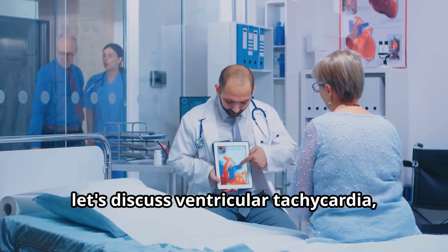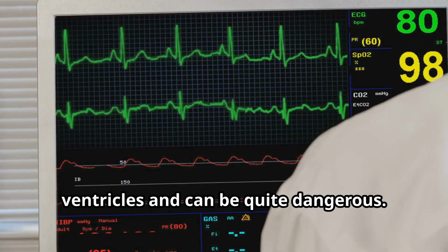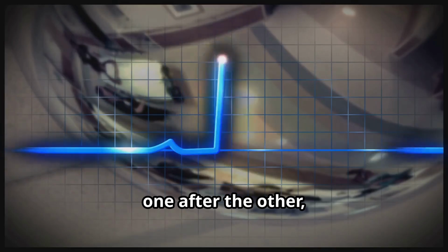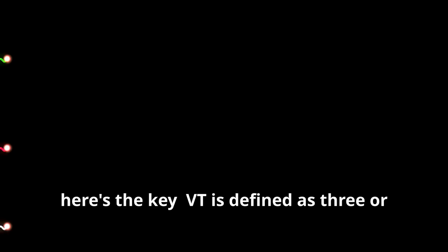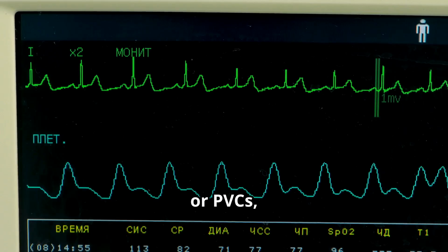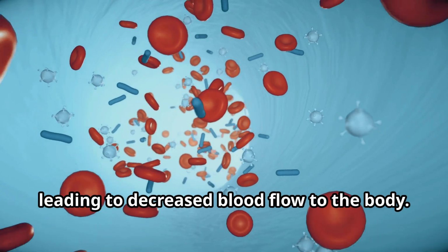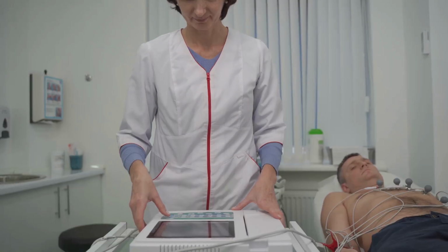Alright, let's discuss ventricular tachycardia, or VT, a rhythm that originates in the ventricles and can be quite dangerous. Picture this. You're looking at an ECG and you see a series of wide QRS complexes, one after the other, with a rate typically above 100 beats per minute. That's VT. Now here's the key. VT is defined as 3 or more premature ventricular contractions, or PVCs, occurring in a row. These rapid heartbeats can prevent the heart from filling properly with blood, leading to decreased blood flow to the body. It's a serious situation that requires prompt treatment.